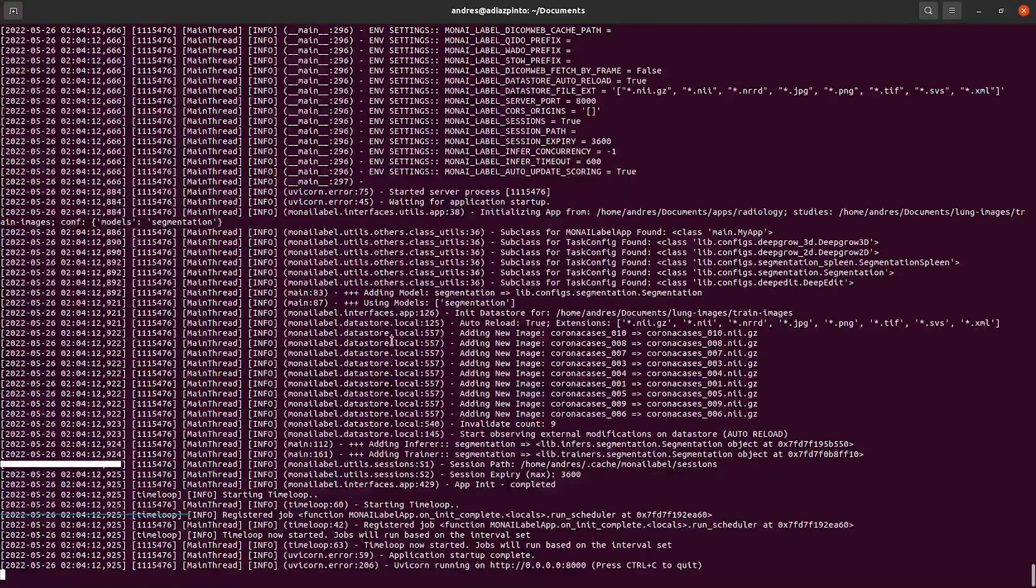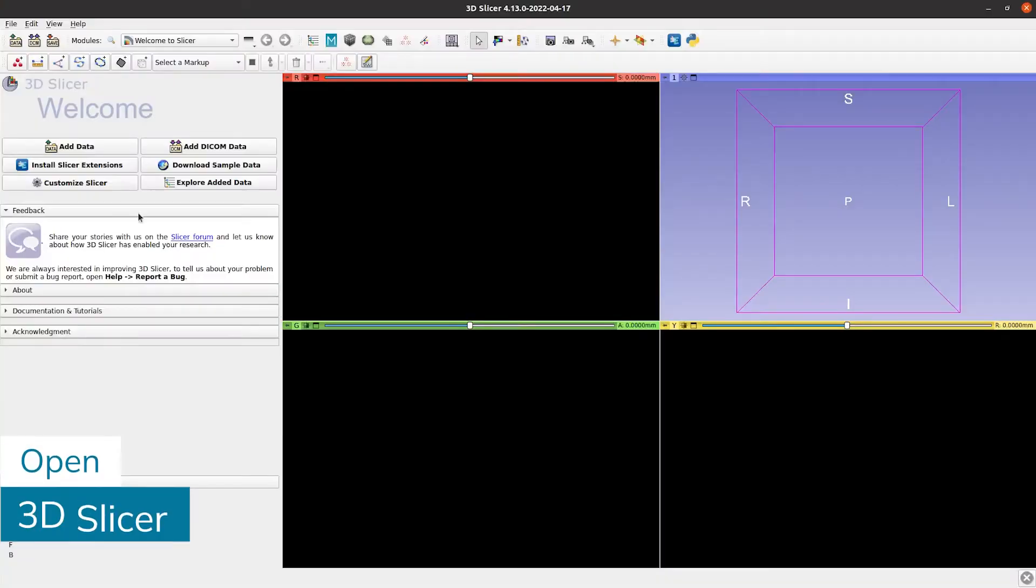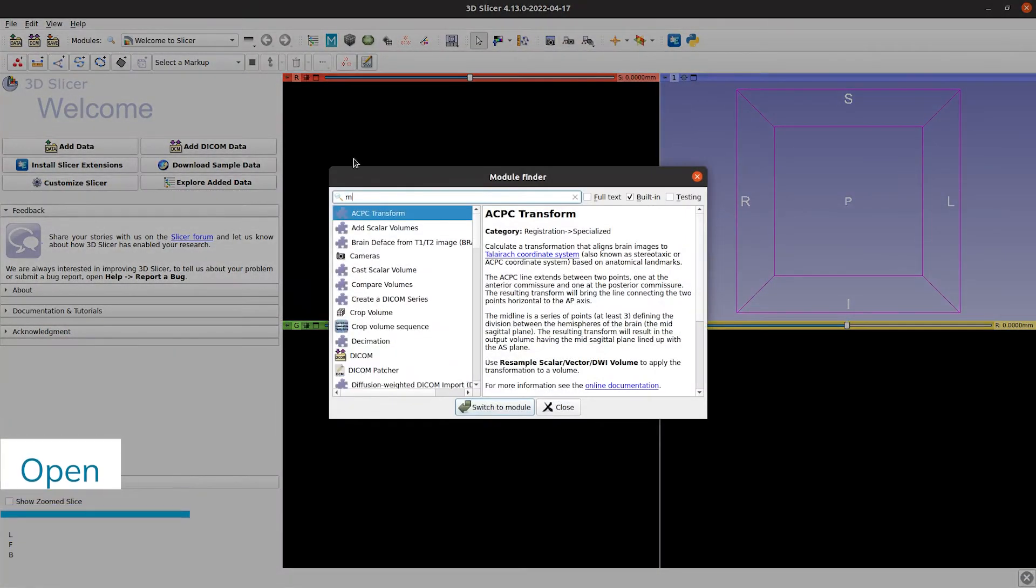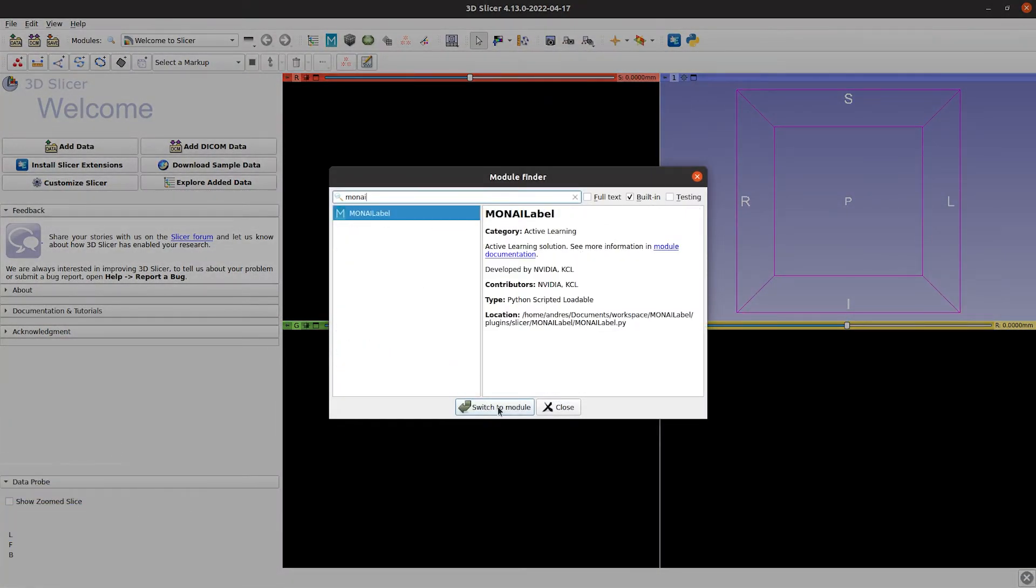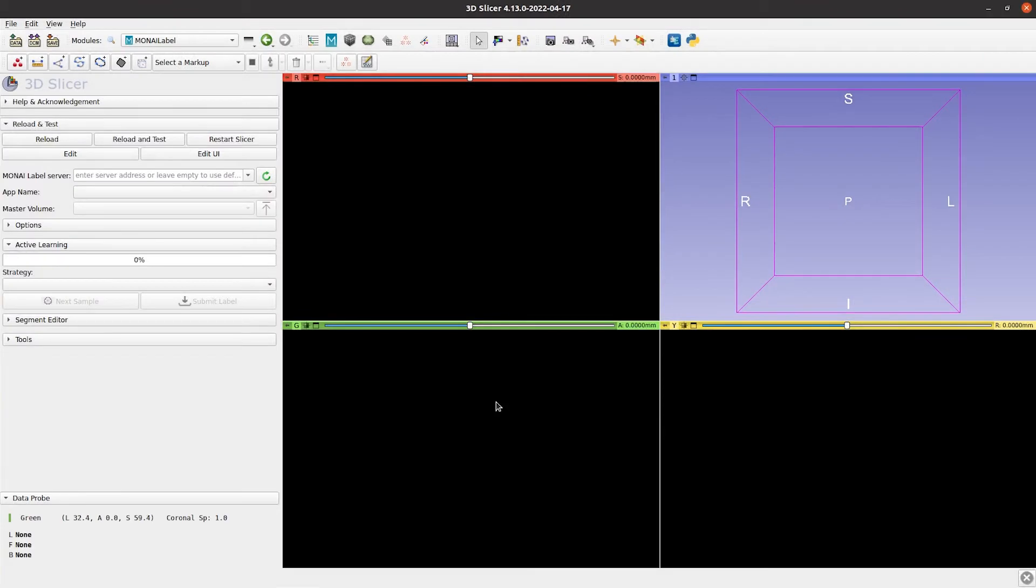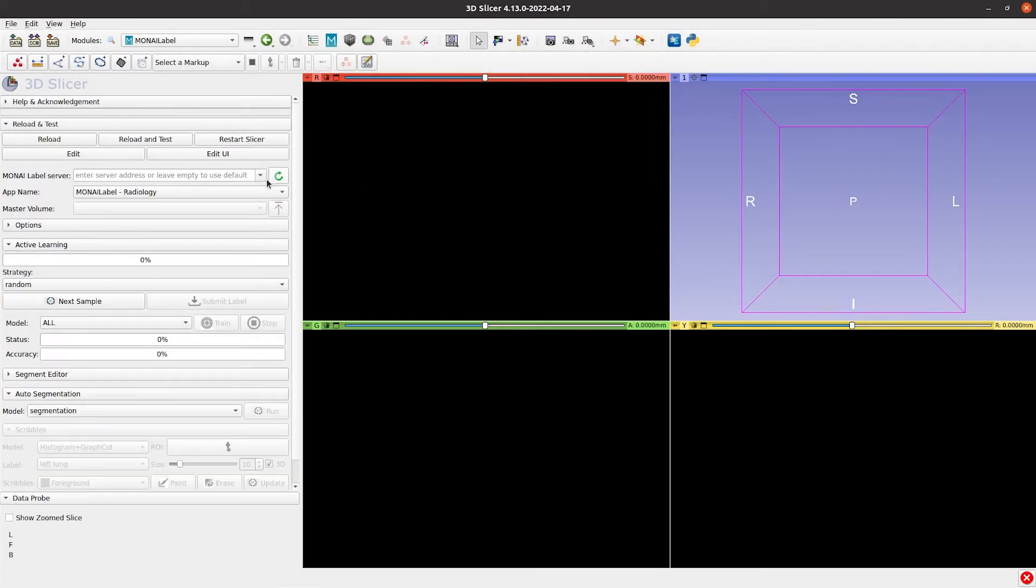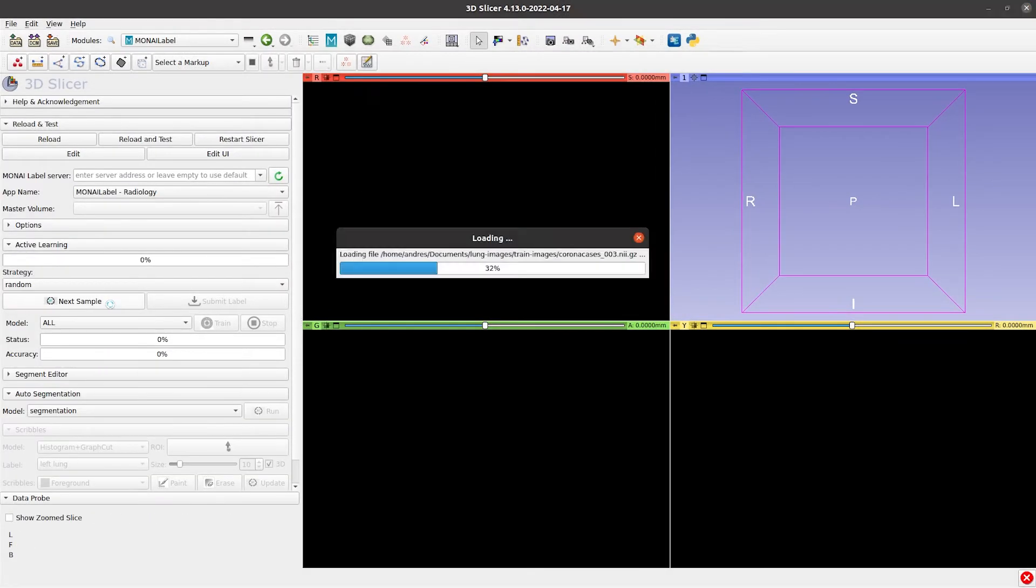Once the server started, we go to Slicer, search for the Monoilabel module, connect to the server and fetch the next sample.